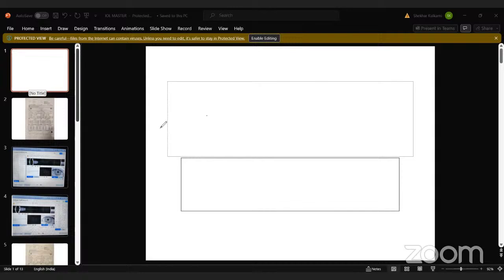And if the patient is using contact lenses, we should advise the patient to stop using them prior to the scan. For soft contact lenses, it should be at least 2 to 3 weeks. For hard contact lenses, the period increases, like 3 to 4 weeks you have to advise to stop. There are multiple modes in the IOL Master, an automatic mode and a manual mode.